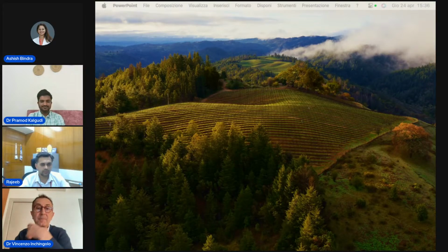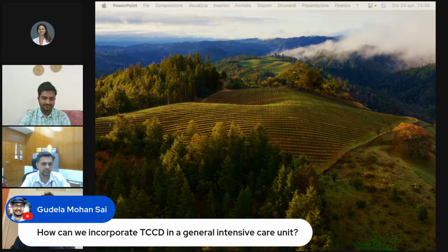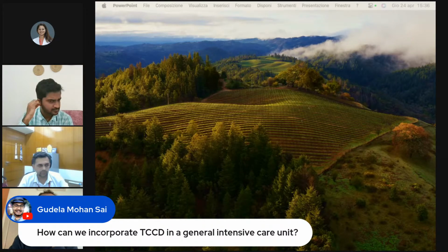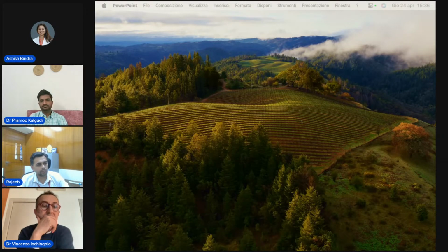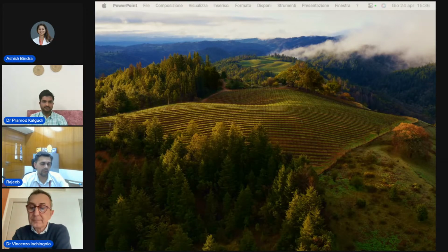Thank you, Professor Enzo. It was a nice presentation of these two cases. So we will discuss a few questions. I will ask a few questions to Dr. Pramod, and Professor Enzo can also help us in that regard. I have a few questions with regard to estimation of non-invasive ICP using TCCD or TCD. What is the problem with the PI-based formula, or the problem with the estimated CPP formula?